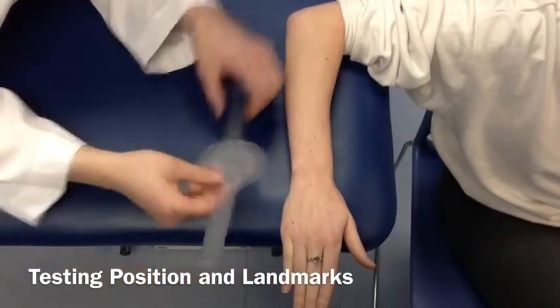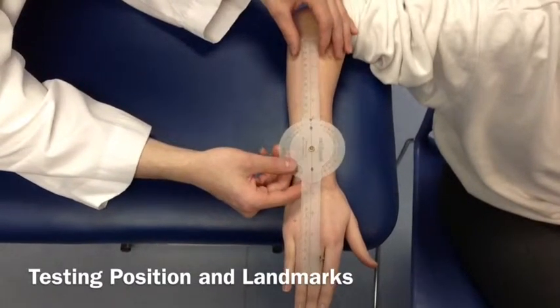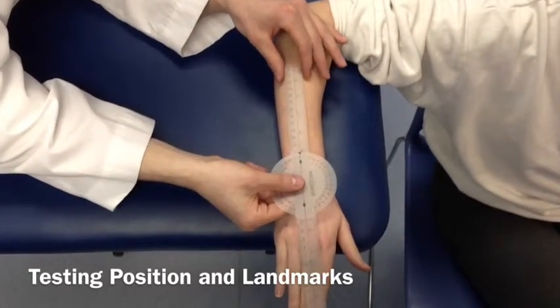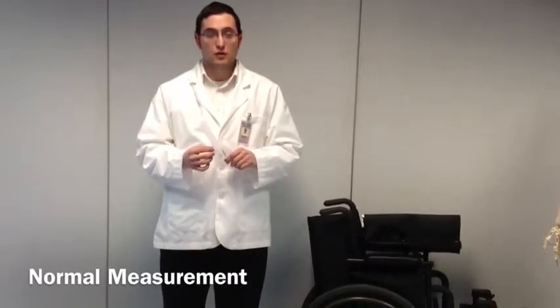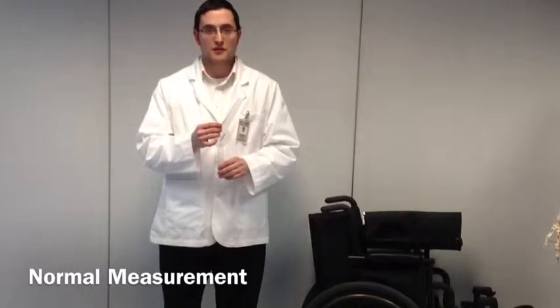We have our fulcrum on the capitate and our stationary arm in the mid-forearm. Norkin and White cite the American Academy of Orthopaedic Surgeons that the normal range of ulnar deviation is between 0 and 30 degrees, with 30 degrees being normal range.